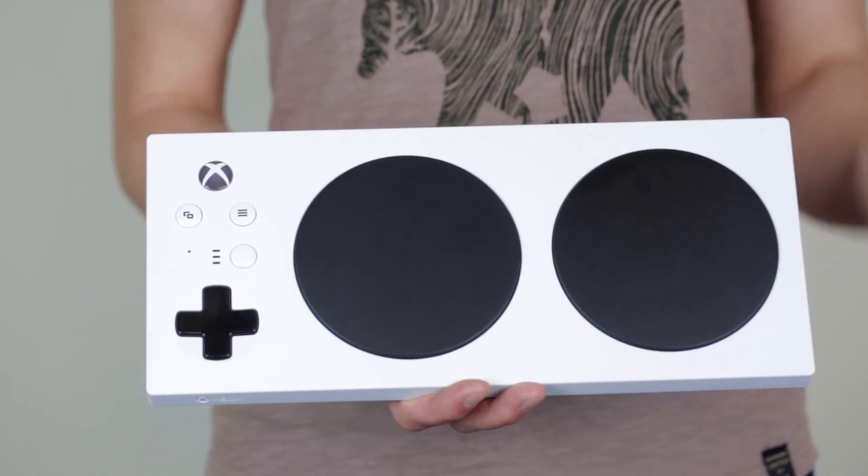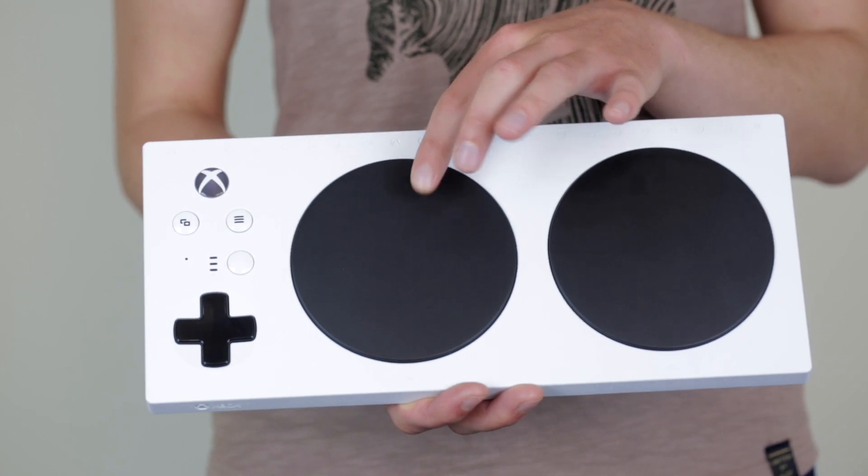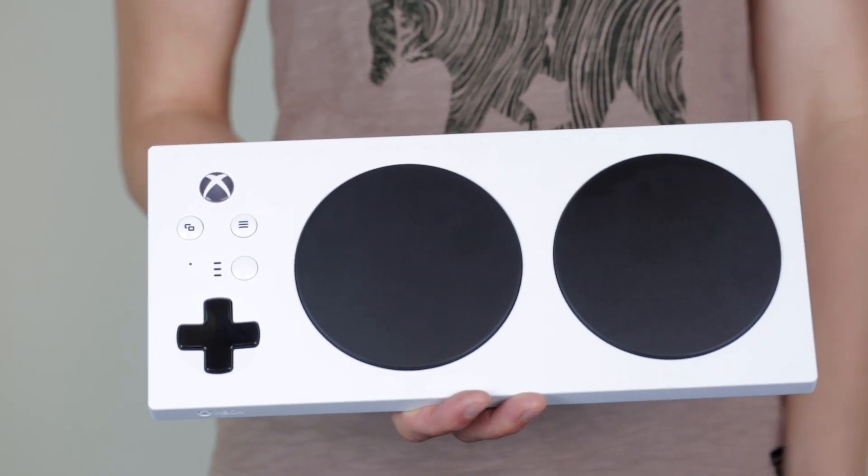The Xbox Adaptive Controller has two large black buttons on the front of it. These are mapped to A and B as default. However, they can be remapped to any button on the controller.